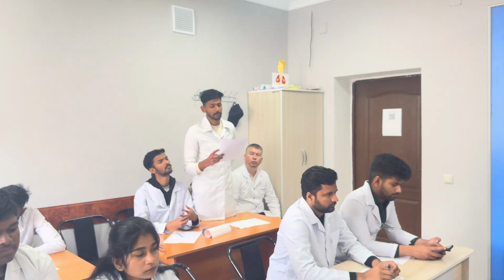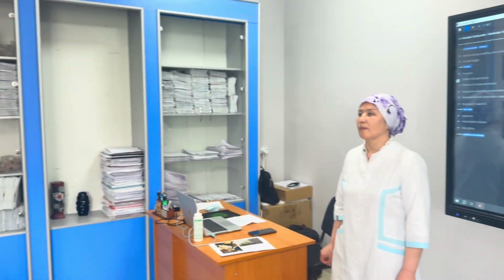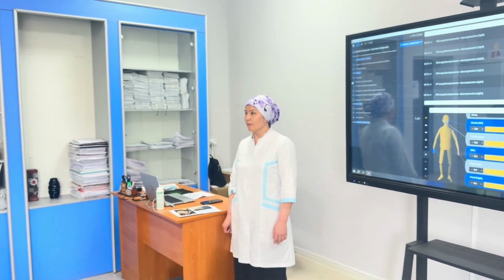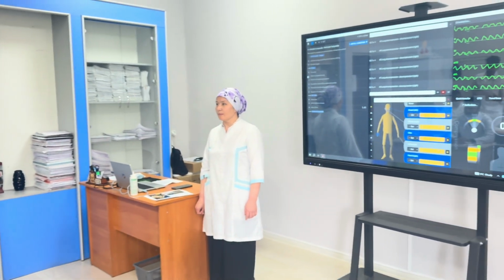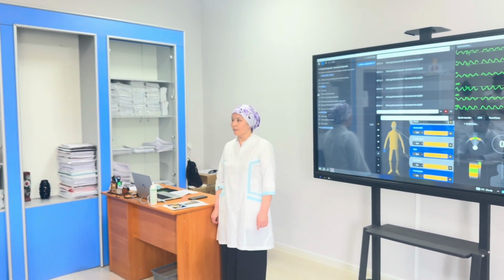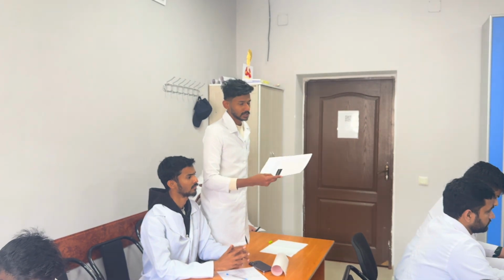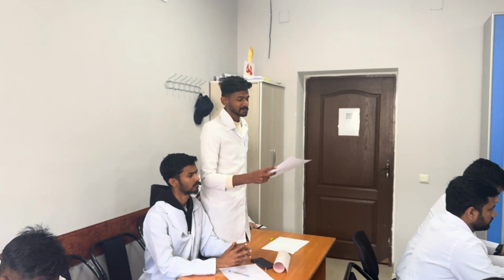So most probably it is ventricular fibrillation, because ventricular fibrillation is denoted as coarse ventricular fibrillation. Fine ventricular fibrillation will be a small line, but in this ECG we can see coarse ventricular fibrillation. Ventricular fibrillation mostly occurs when the ventricular part is not acting properly, or it will be tachycardic, because of the shift of the SA node or a pathology in the myocardium.